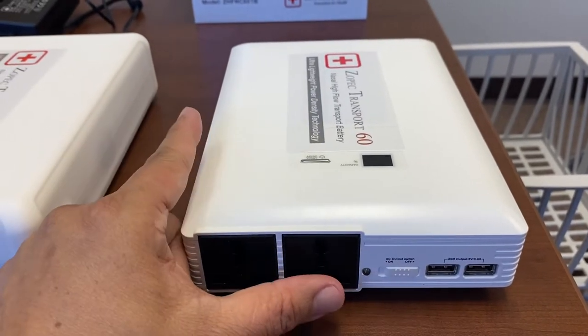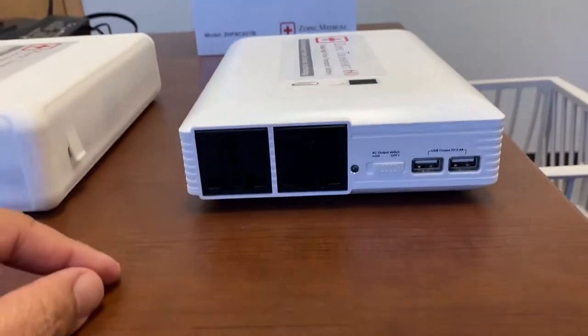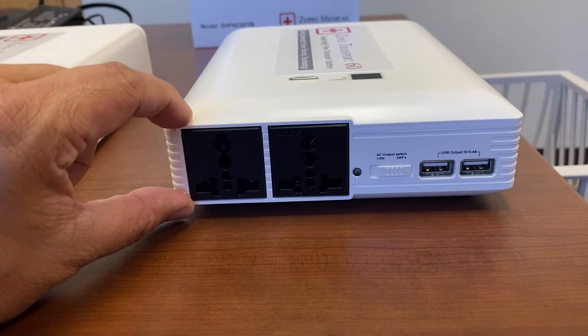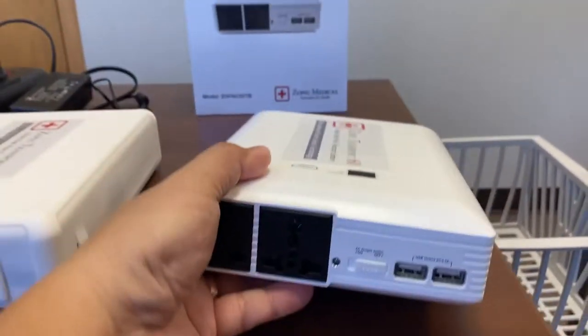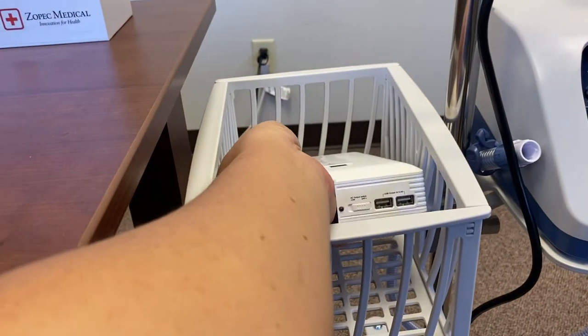It's eight inches long, only six and a quarter inches wide, and two inches tall. The weight is only three pounds, so it's very light and it fits in the basket very easily.